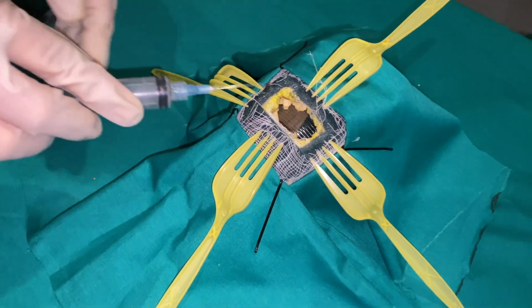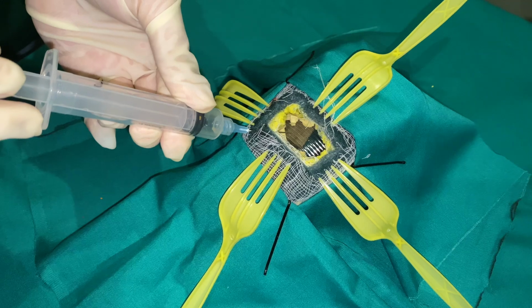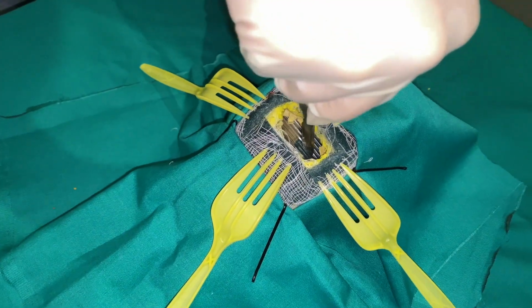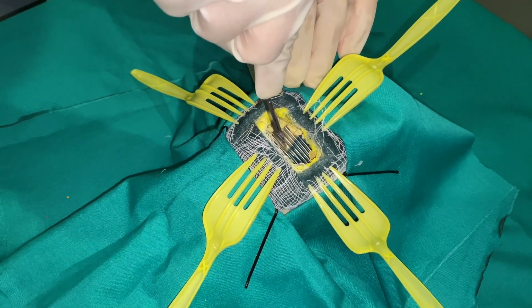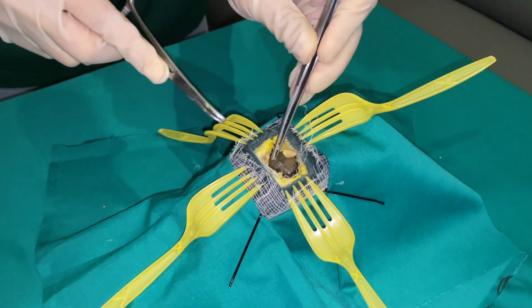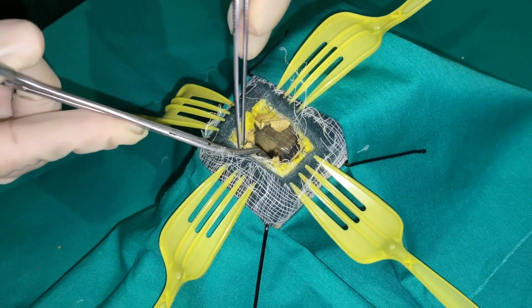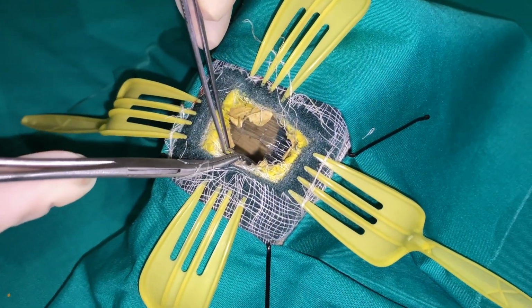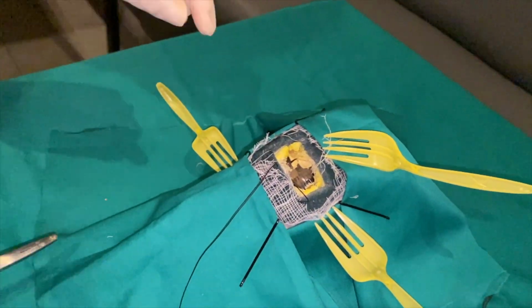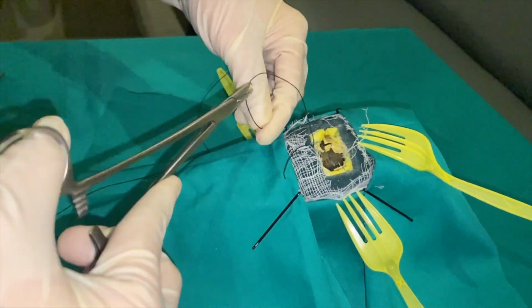If there is a doubt whether it's trachea or a carotid artery, aspirating air with a needle attached to a syringe will confirm its location. Create an inferiorly based flap raised from the anterior wall of the third and fourth tracheal rings. This is the safest tracheostomy in adults. After the flap is created, a silk traction suture is passed through the anterior tracheal flap, which is loosely secured to the skin.